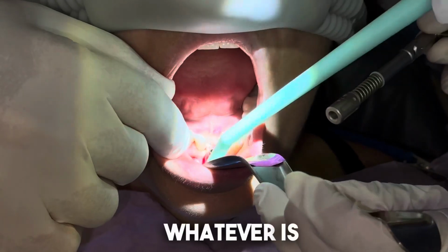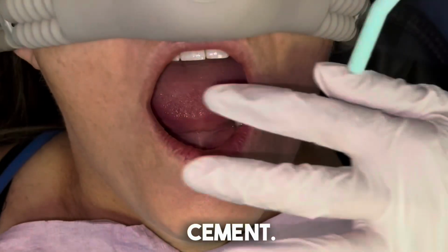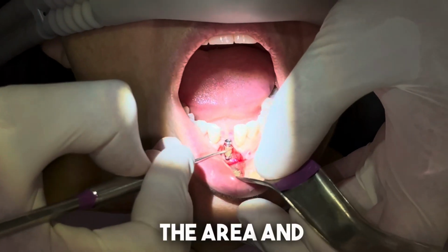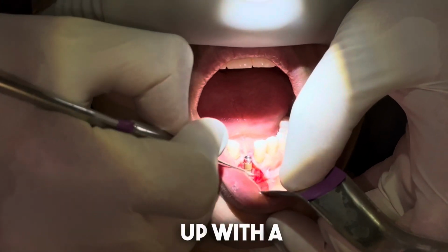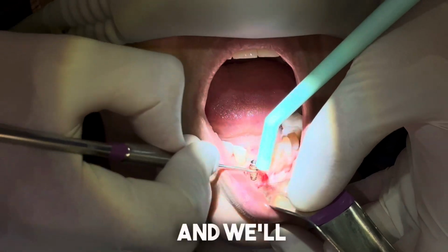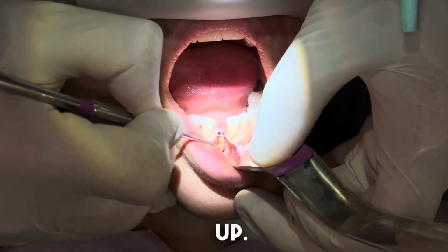Now, whatever is exposed, we're actually going to cover it with what we call bone cement. And you're going to see a white powder that after we clean around the area and prep it, we're going to cover it up with a cement that basically turns into jawbone, and we'll cover that up with the tissue and stitch it up.